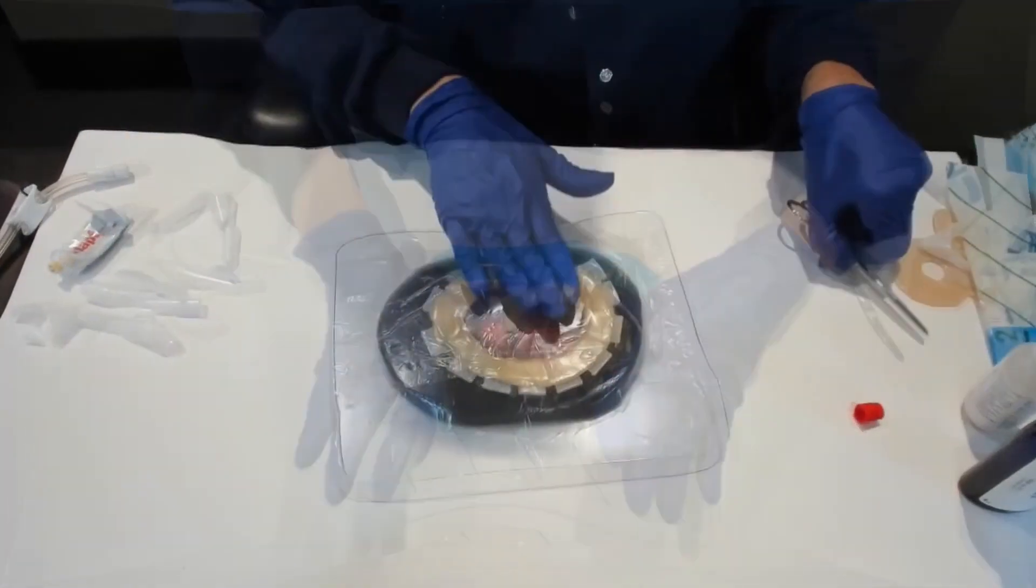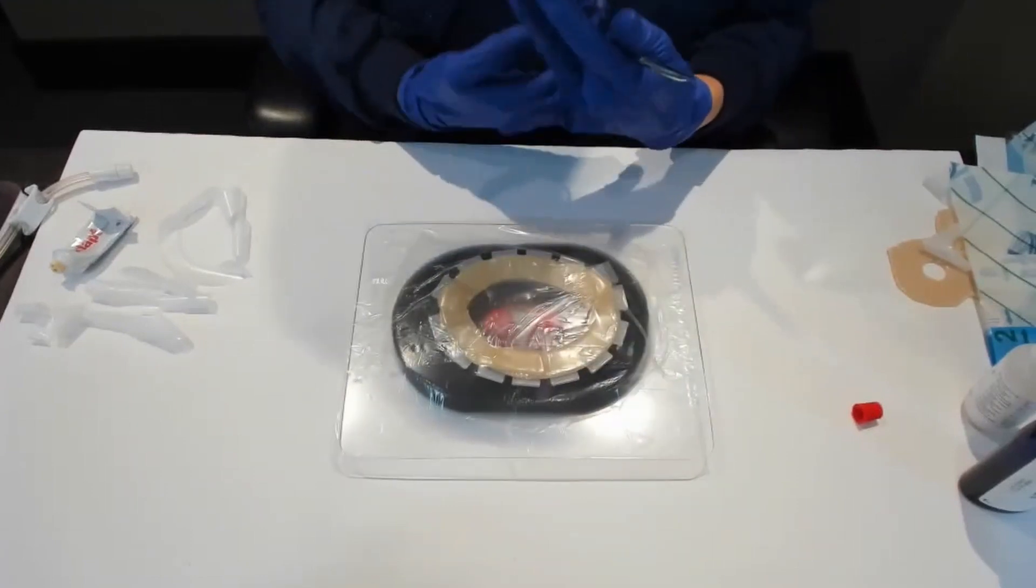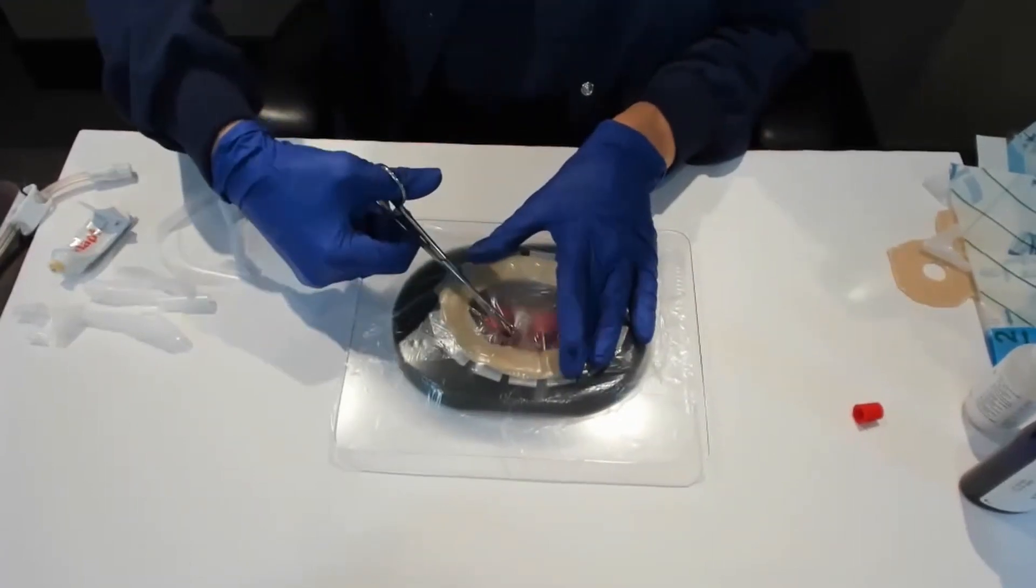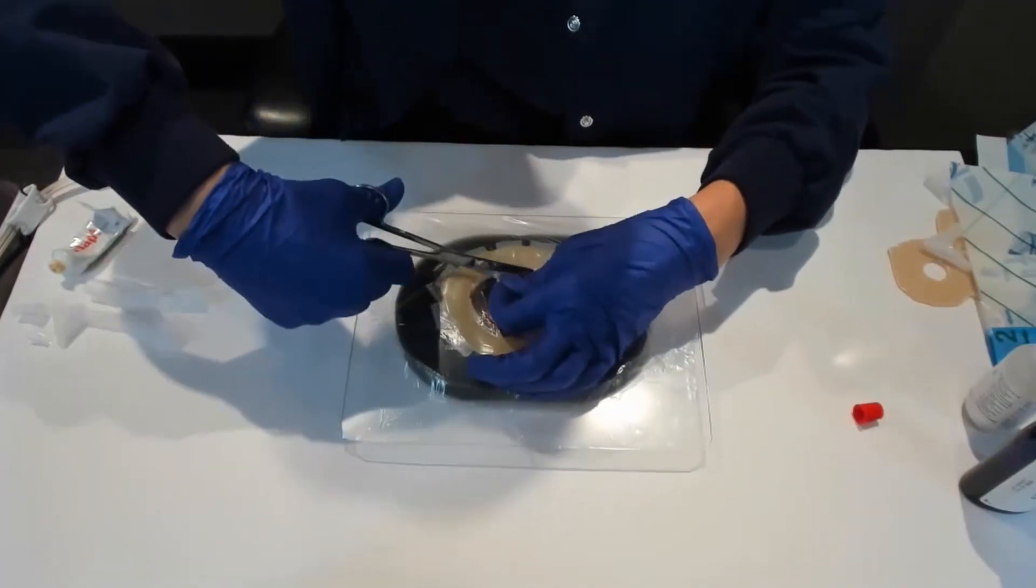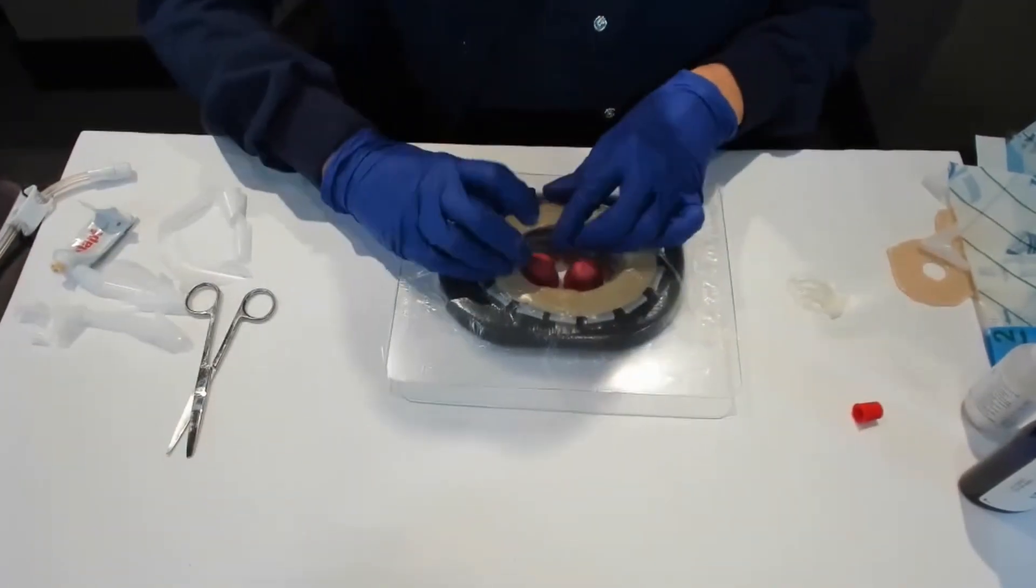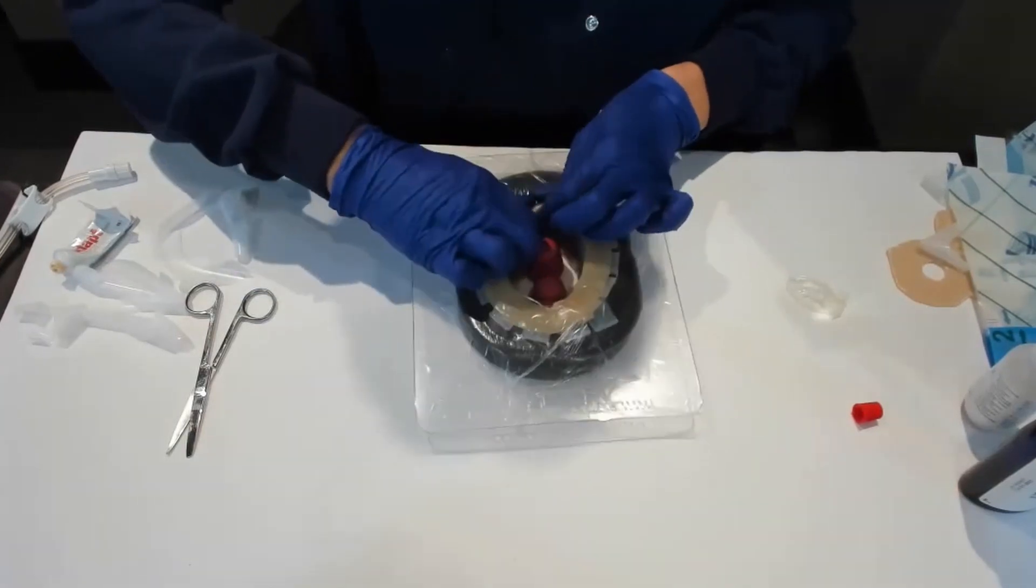Now you've got your cute little fistulas on the inside. You want it to kind of curl underneath there because that's going to help you get your seal.